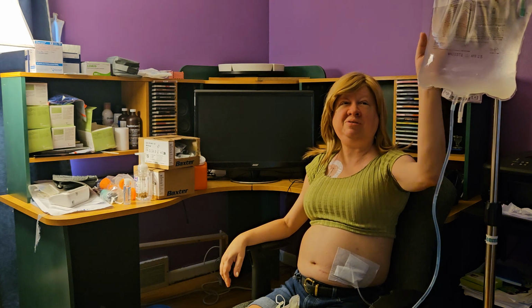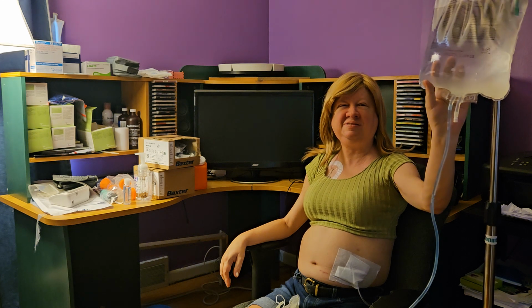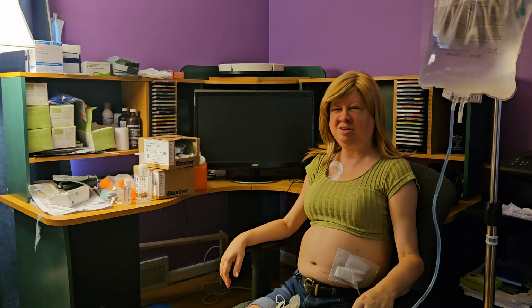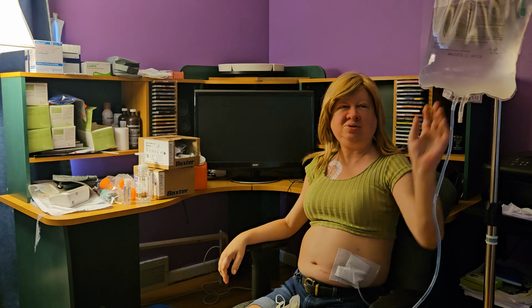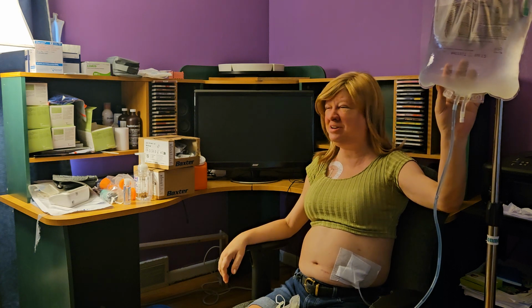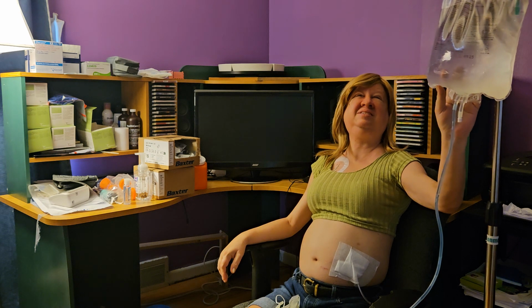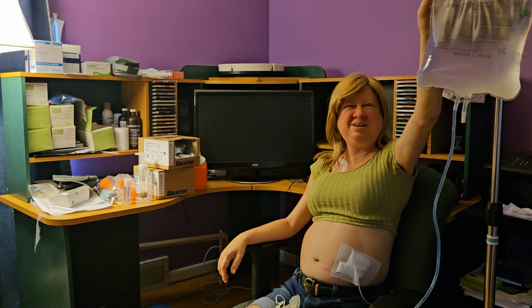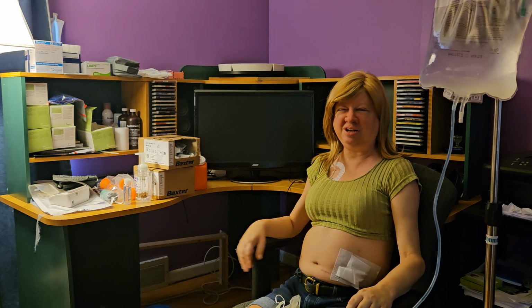I usually have to put one of these bags in a warmer to warm it up to, like, body temperature. Depending on if my blood pressure is high or low, I use a different colored solution bag. This one's green. Or is this green or yellow? This one's yellow, right? It's supposed to be like a yellow seal to it somewhere. The one before this, the one that's draining now, is green.